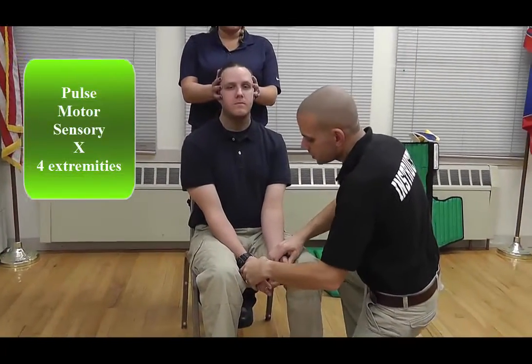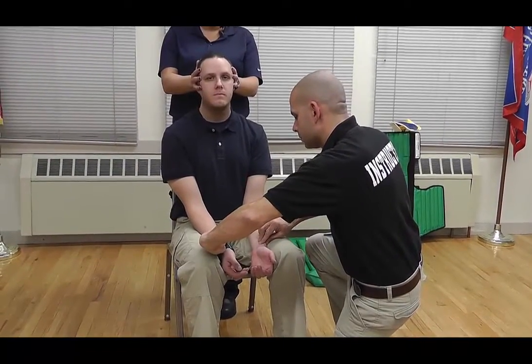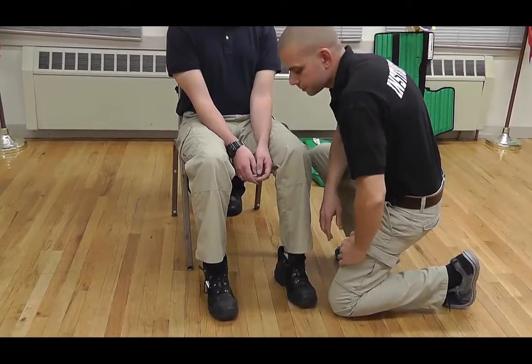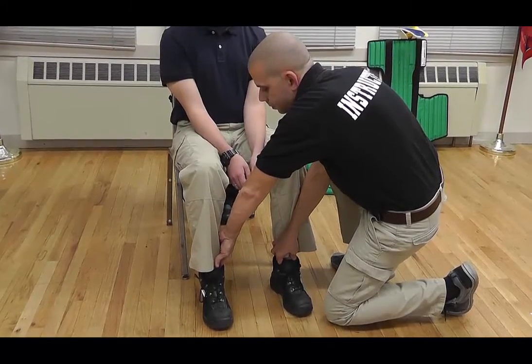Chris, can you feel me touching your hands? Yes. Wiggle your fingers for me. Pulses are present. Chris, can you feel me touching your toes? Yes. Wiggle your toes for me. Pulses are present.